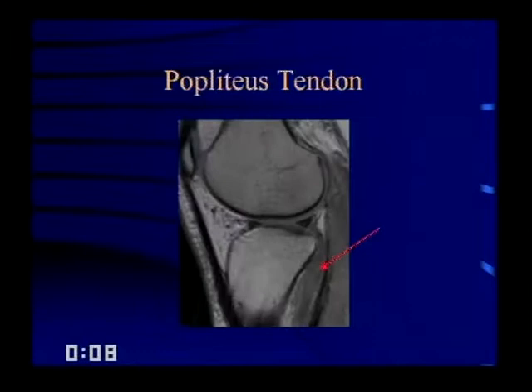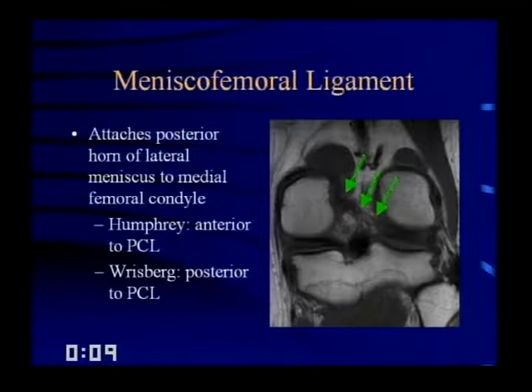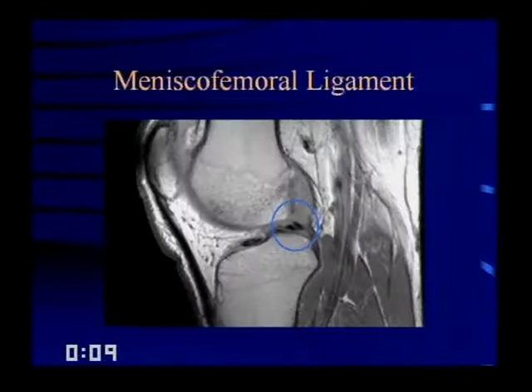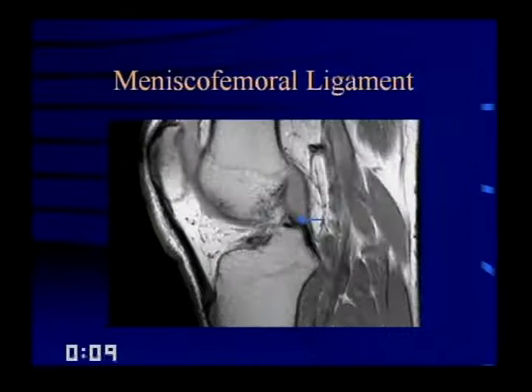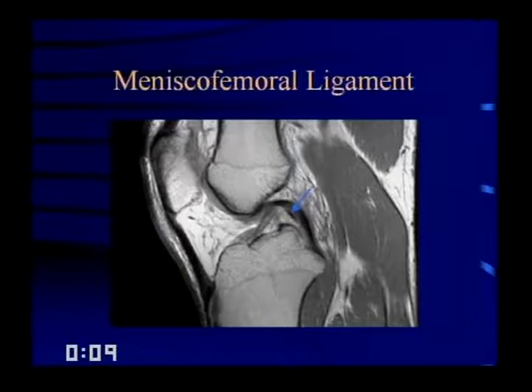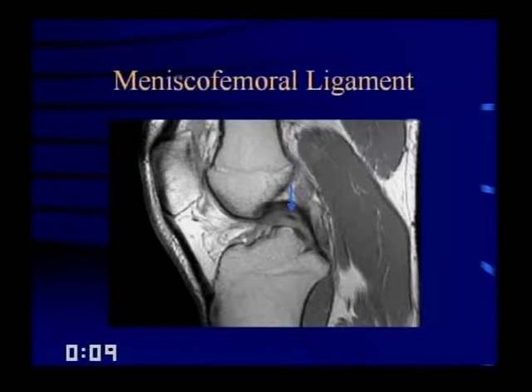Meniscofemoral ligaments attach to the posterior horn of the lateral meniscus and extend up to the medial femoral condyle. There are two: the ligament of Humphrey, if anterior to the PCL, and the ligament of Wrisberg, if posterior to the PCL. The takeoff of this ligament from the posterior horn of the lateral meniscus can mimic a tear. Following it, you see it's really just the takeoff of that ligament — this must be Humphrey since it's anterior to the PCL — and you can follow it all the way up to the medial femoral condyle.